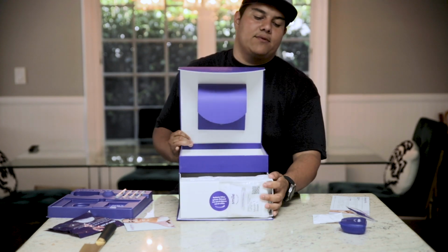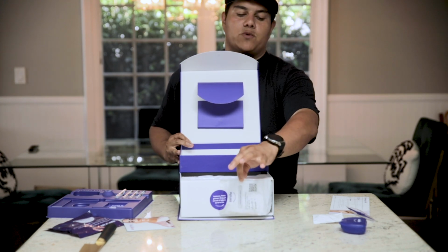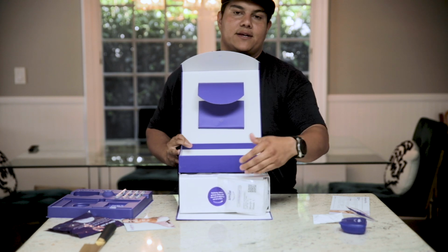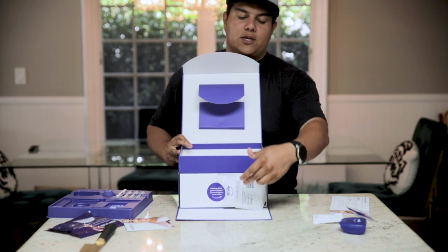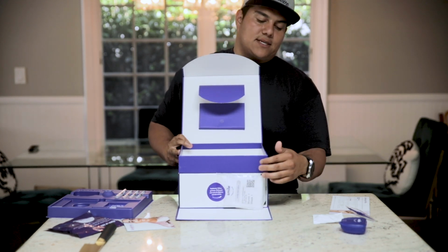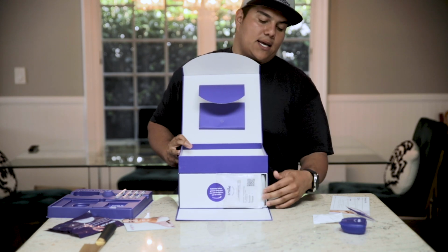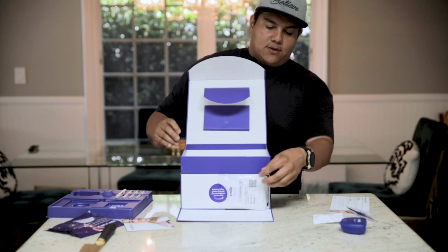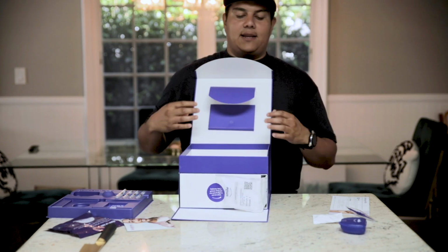But the way they have it, once you remove one, you pull the other one, and it's supposed to be the next aligner that you wear after you're assigned the week. So this one is supposed to be just for week 1, and then I pull the next one out and it's week 2, I'm assuming. So let's do that. Oh, and if you are wondering how long it took, I think 2 weeks.